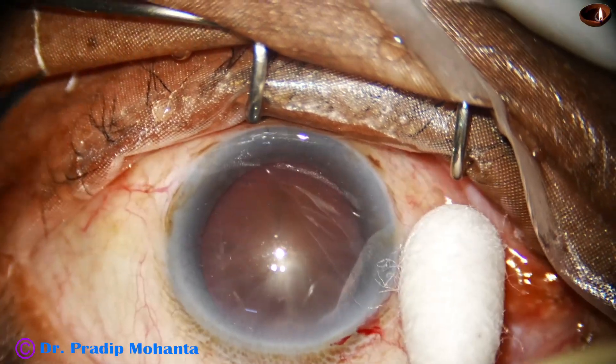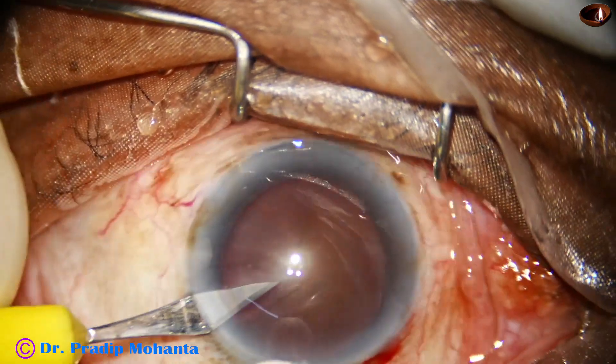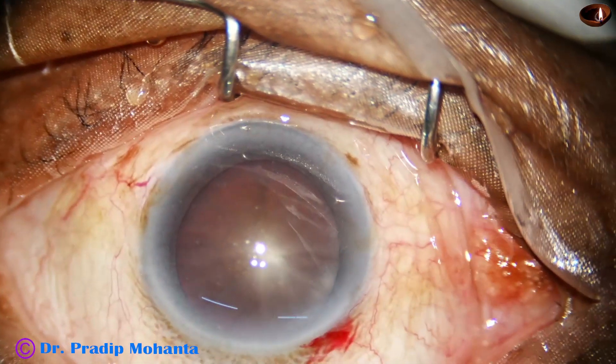The main incision has been made. This is a side port on the left side of the main incision, three o'clock hours away.